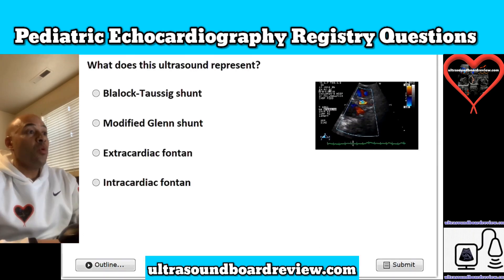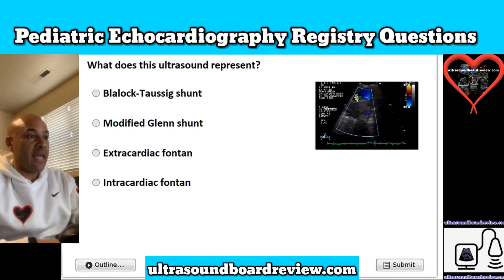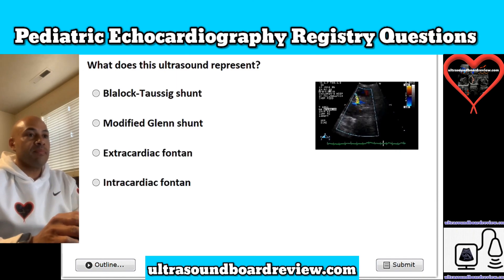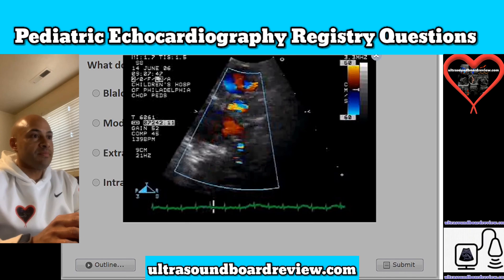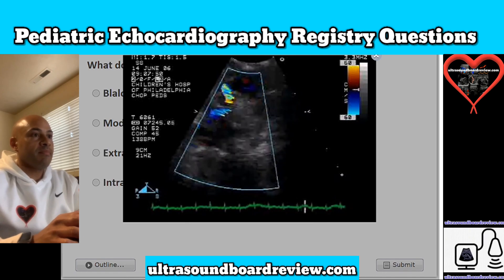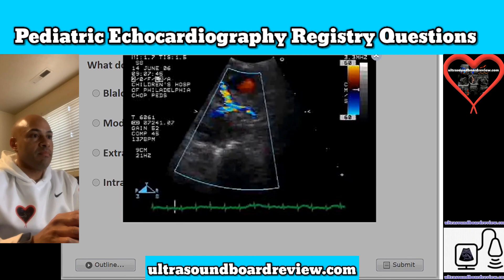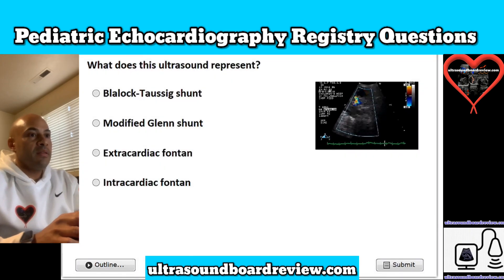Question 19. What does this ultrasound represent? Is it A, a Blalock-Taussig shunt; B, modified Glenn shunt; C, extracardiac Fontan; or D, intracardiac Fontan? The answer is A, Blalock-Taussig shunt.